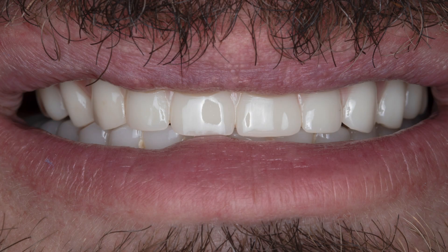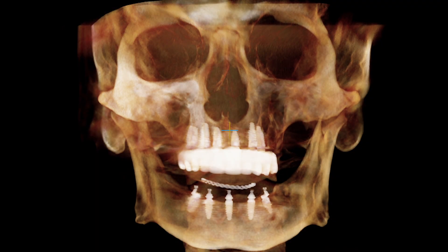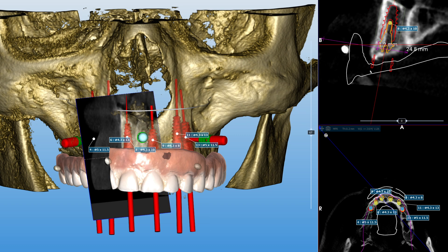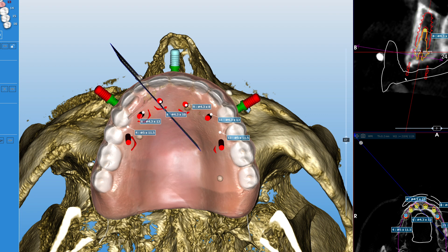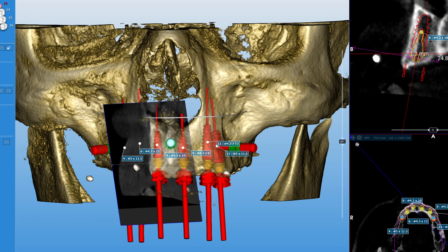With the patient sitting upright, the occlusion is verified. Ideally, there should be minimal working and non-working contacts, with evenly distributed centric contacts to provide freedom of movement while minimizing the lateral stresses on your implants. The implant positions were confirmed utilizing a post-op CBCT image. This is Dr. Taylor Manalili. Remember, advanced procedures like the immediate loading of implants for fixed full-arch restorations are becoming more predictable with the advances in technology. Prosthetically driven guided implant placement really allows for the optimal restorative outcome and happy patients. Stay tuned for more clinical technique videos. Thank you.